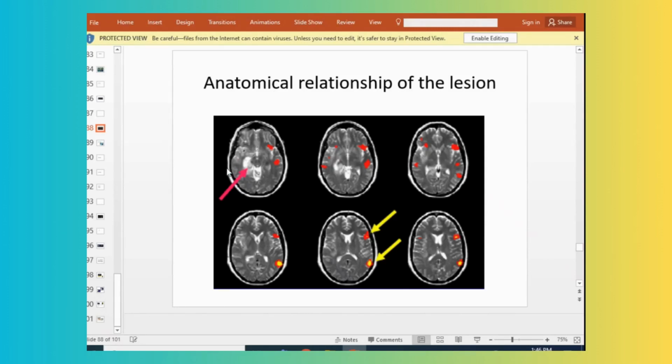Temporal lobe is not needed for life, for your daily function. Temporal is just memory and emotions, basically limbic system. Otherwise, temporal lobe is not needed. But if the tumor is in the language area, for example on this side, they will be careful. They will think twice, or they may not go in for a low-grade glioma. They will just do biopsy.